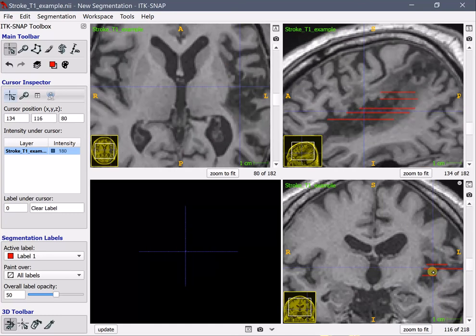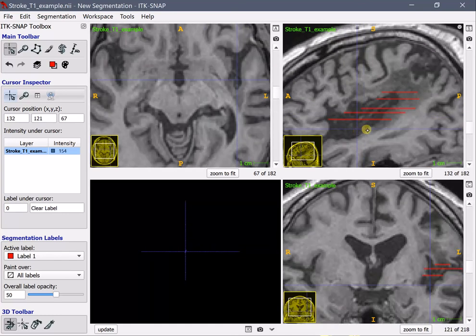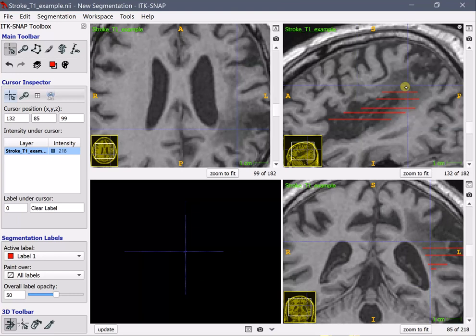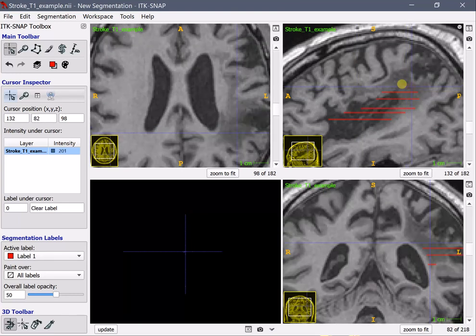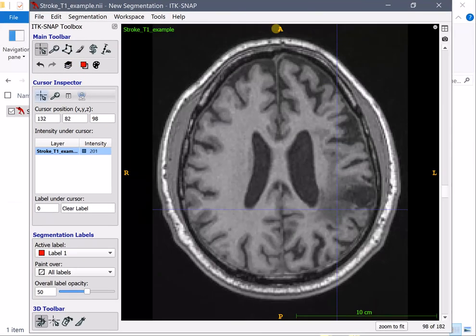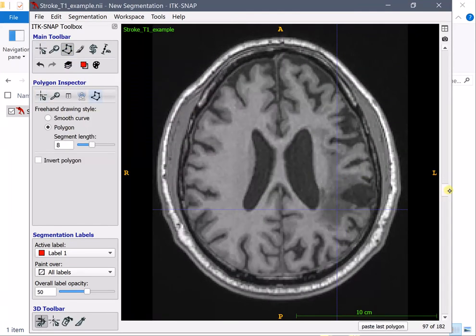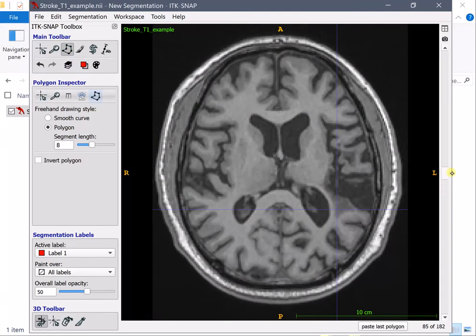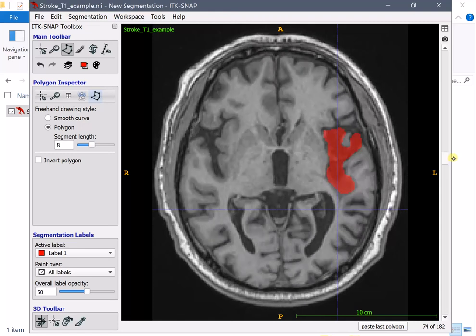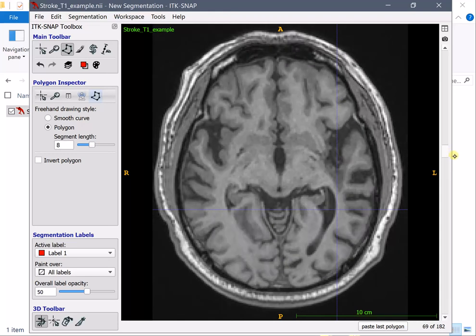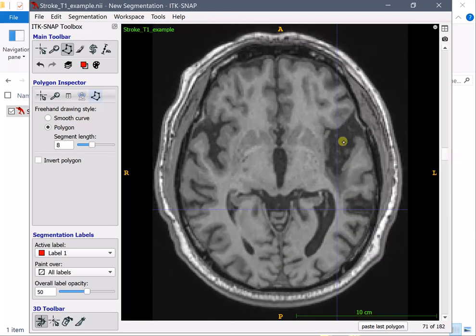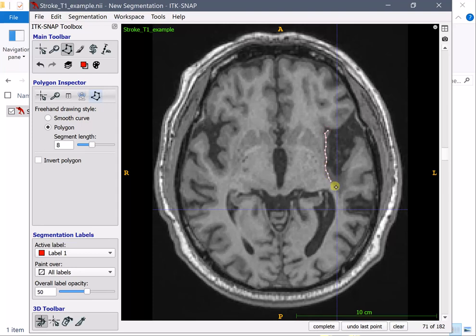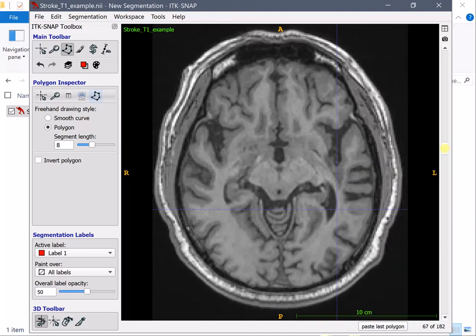Go back in the cursor inspector mode and you can loop around to see the shape of the lesion if you're uncertain if one certain point is lesion or not. Now let's go back in our axial space and let's go back in our polygon mode. So what I'm going to do now is try to fill all the missing slices up onto the inferior portion of the brain and then I'm going to go all the way superior.